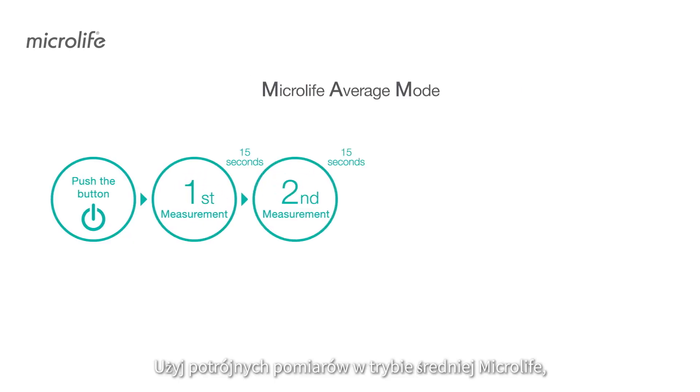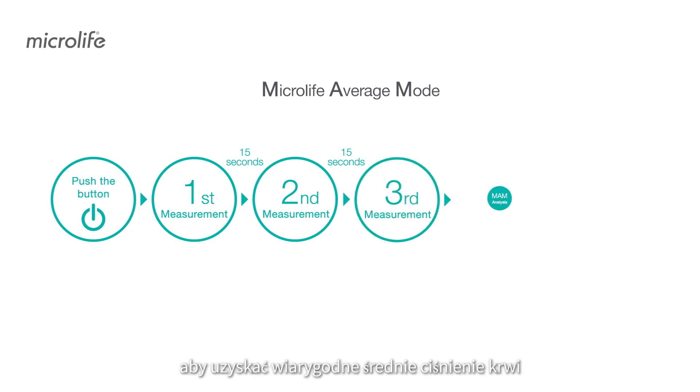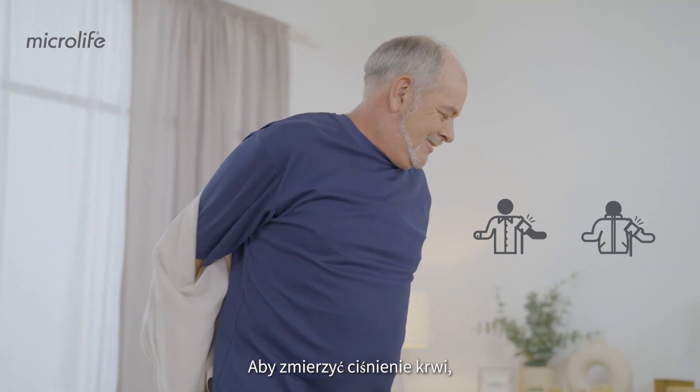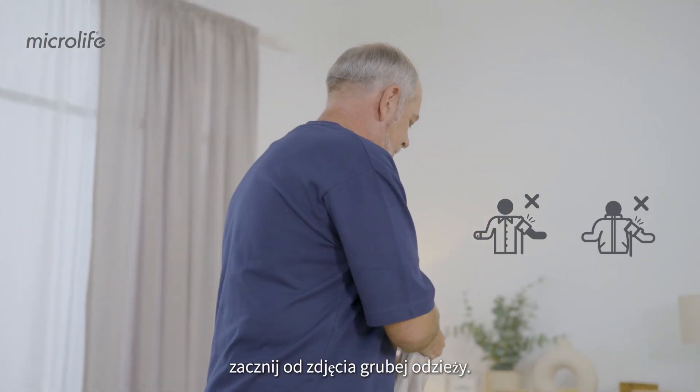Use Microlife Average Mode's triplicate measurements to obtain a reliable blood pressure average, as recommended by doctors. To measure your blood pressure, start by removing any thick clothing.